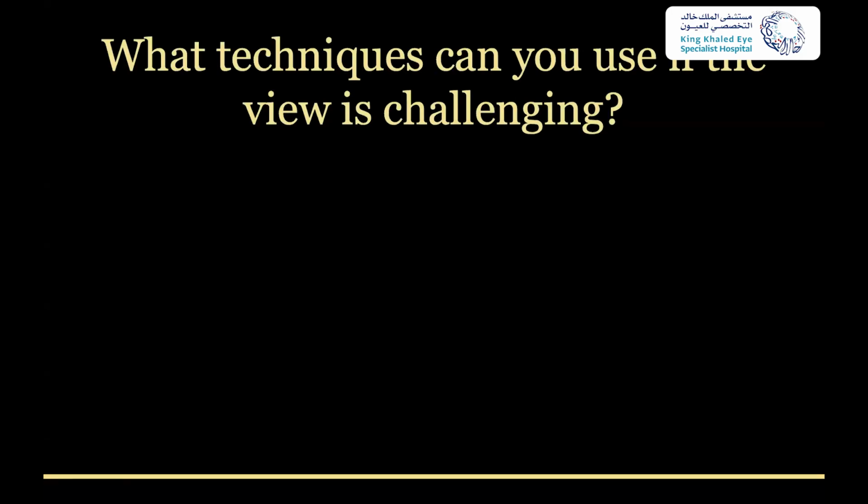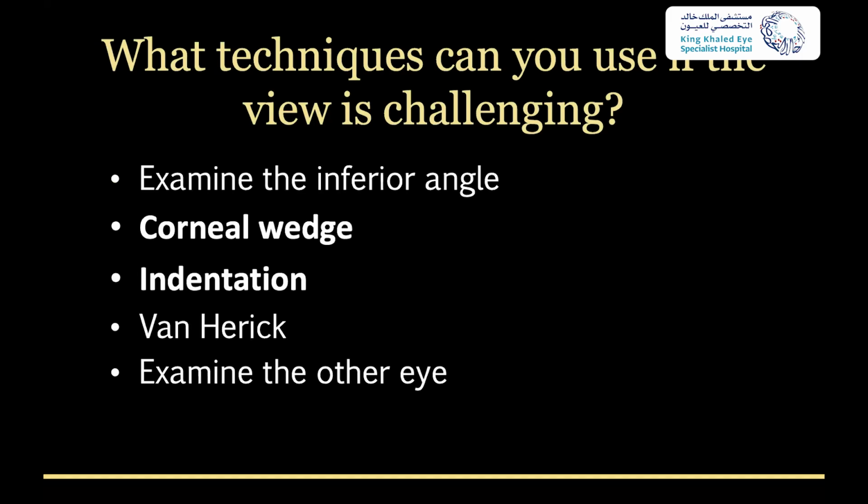So this is all well and good if the view is easy, but what if the view is challenging? You look in and you have no idea what you're looking at. And so I'm going to talk about a couple of techniques that might help you be a better gonioscopist. And of these 5 things, I'm going to highlight the corneal wedge and indentation.